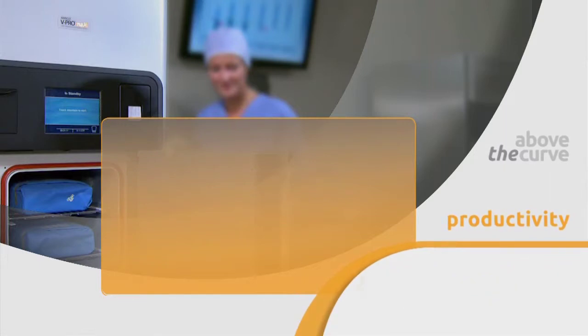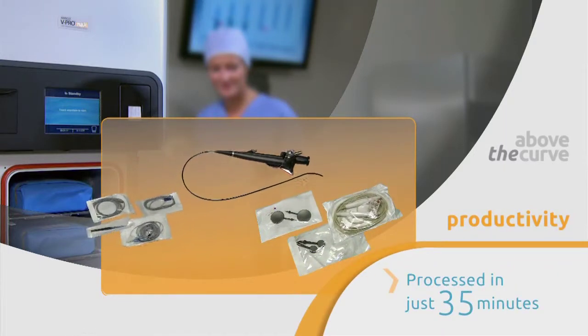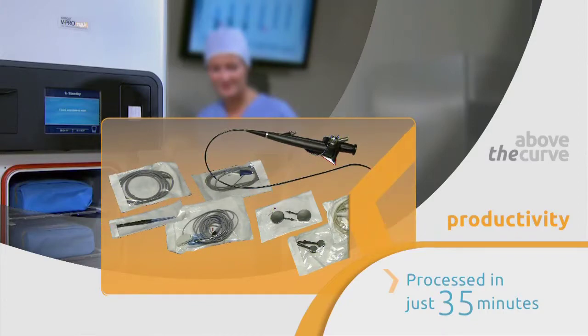With the flexible cycle, you can process a non-lumen load with a flexible surgical endoscope in just 35 minutes.